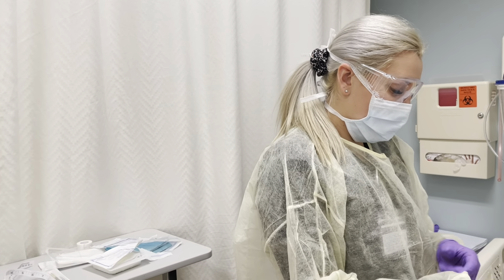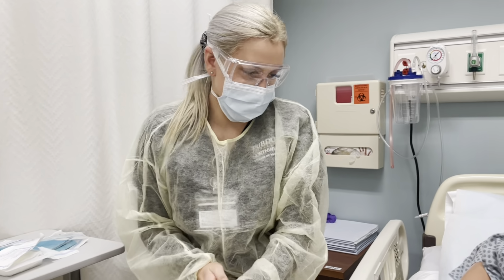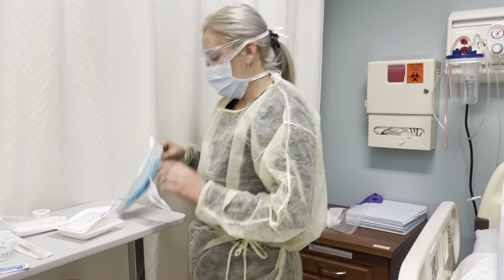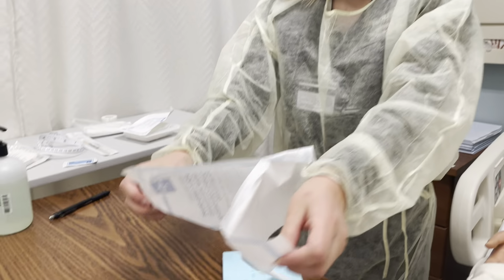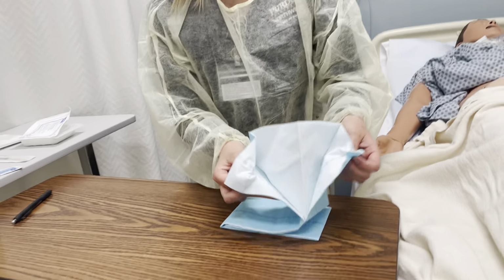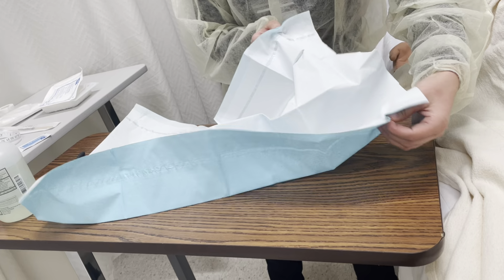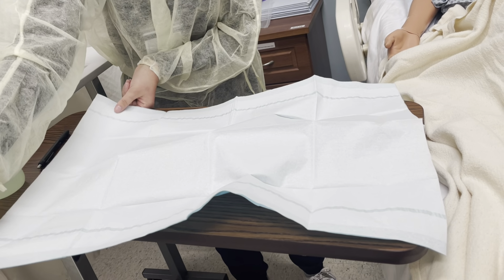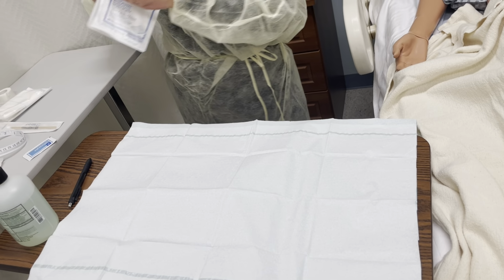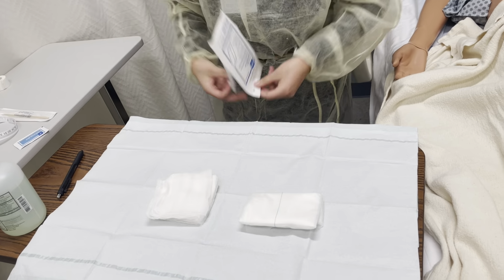Okay, now I'm going to take off my gloves. And I'm going to begin setting up my sterile field, starting with the drape and opening away from me. Throwing that away. And making sure to open this away from me while still maintaining sterility and not touching the sterile part. So I have a 1-inch border and not reaching across. Okay, and now I'm going to open up my supplies and remaining 6 inches above, opening away from me, 6 inches above.